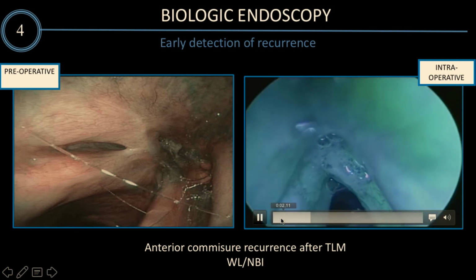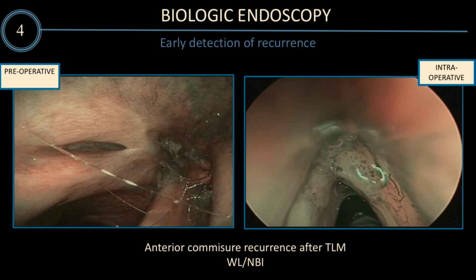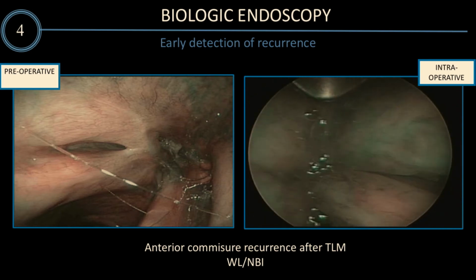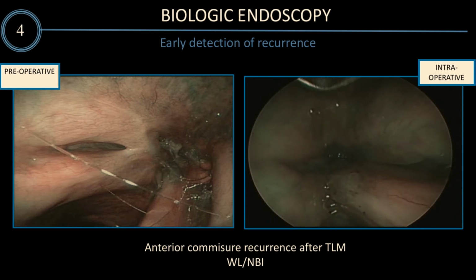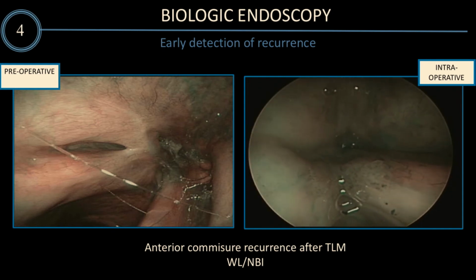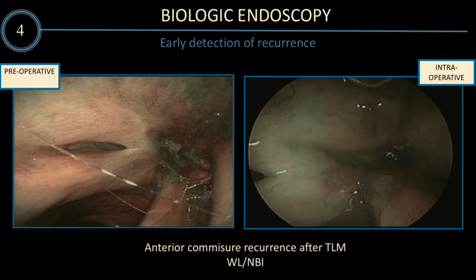In the OR, again, with the angled telescope, the picture changes completely. You can see loops and a dark spot inside the lesion, and with the 70 degree you can better define the boundaries of the lesion. This is very important in order to plan exactly the extension of your resection and to reach the goal to remove completely the lesion with clear margins. This is very important in this kind of surgery.